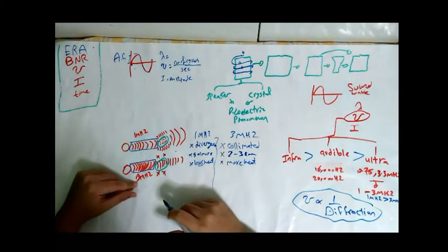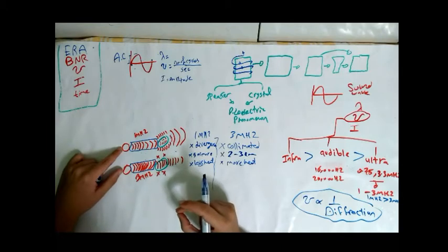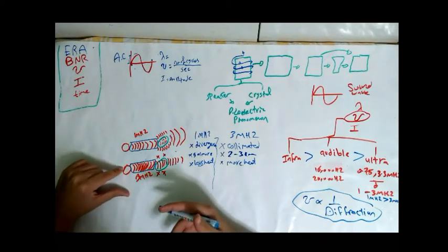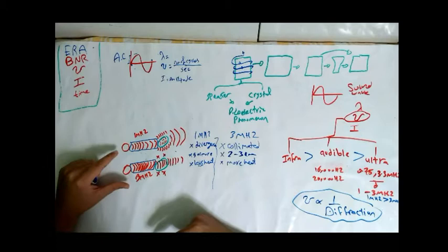If I'm using two transducers, both with the same intensity and the same duration, treating the same region at the same depth with different frequencies, 3 megahertz will cause greater heating of the region than 1 megahertz, because more of its energy is absorbed, while with 1 megahertz less of its energy is absorbed.